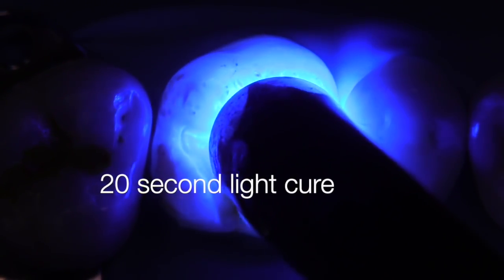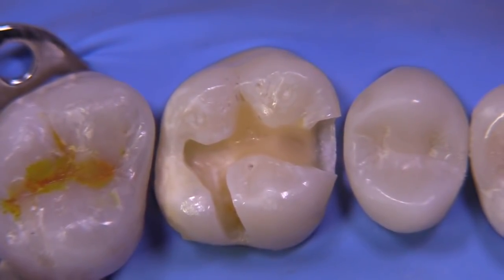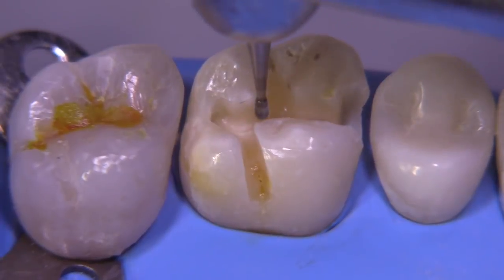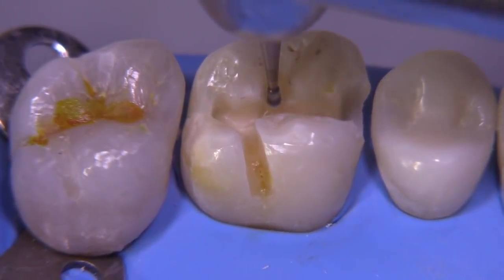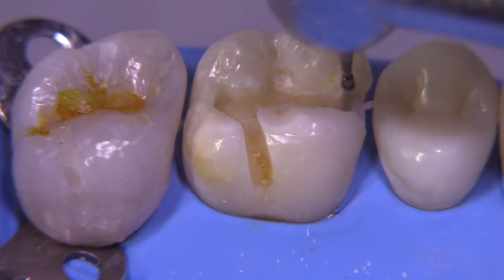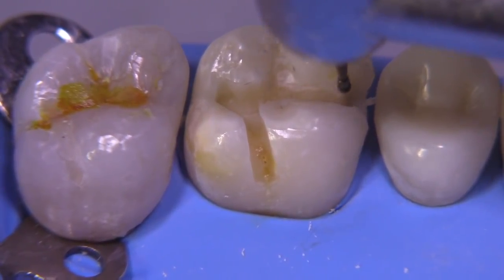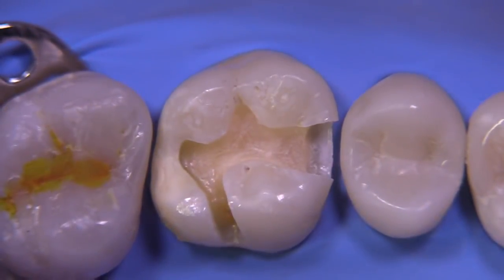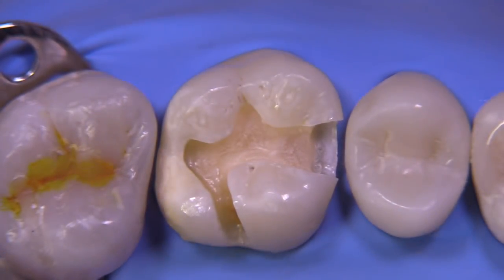The light cure for this product is 20 seconds, so let's make sure you cure it the full 20 seconds with the tip touching the tooth. Now you can see that the liner is all up against the cavosurface margin — this is completely unacceptable. We need to remove all of that. Very easy to do: just place the 330 burr and run it along those walls — the base comes off quite easily. If we had been a little more careful placing the base we wouldn't have to do this. This is also when you could smooth off that little s-curve transition, smoothing the pulpal wall and all the walls of the preparation.